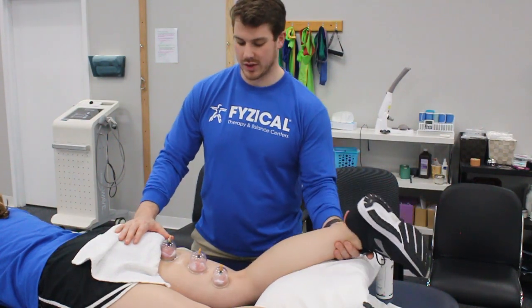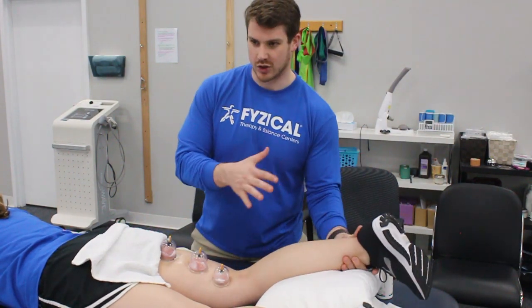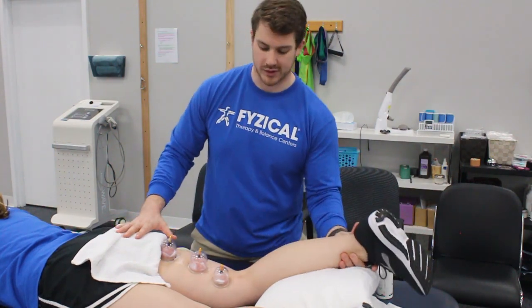Nice passive motion, just so we can move the tissue back and forth and get the most out of this.